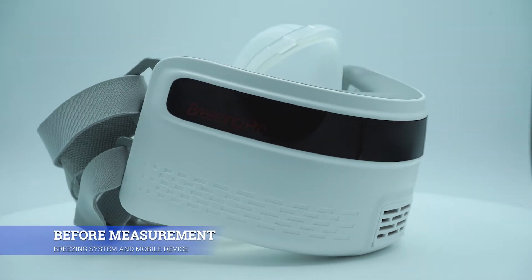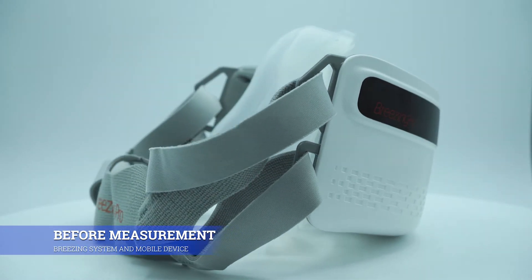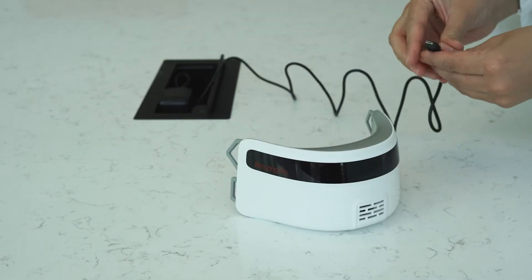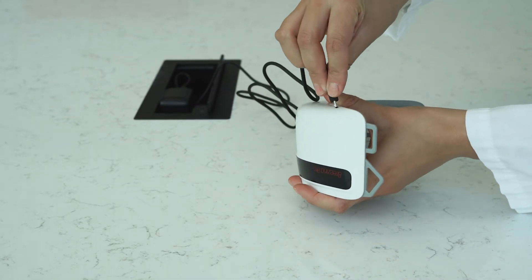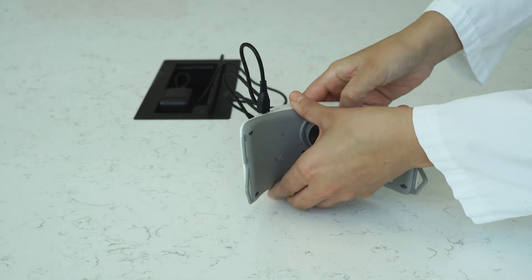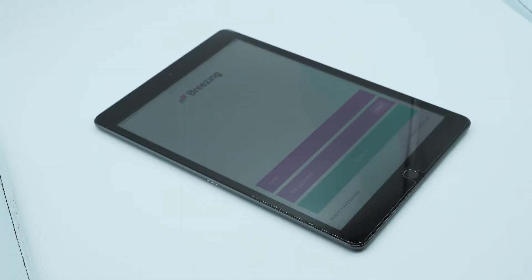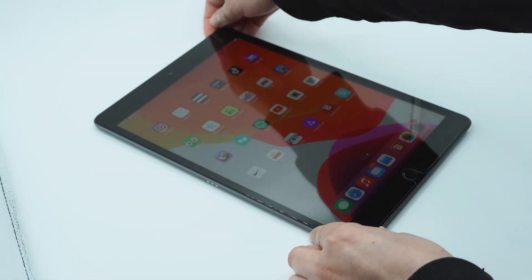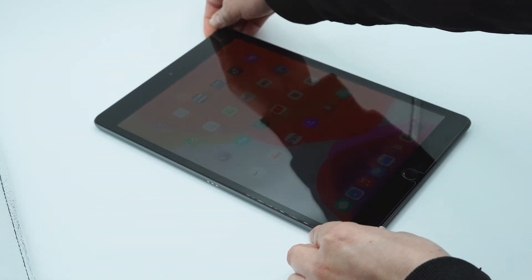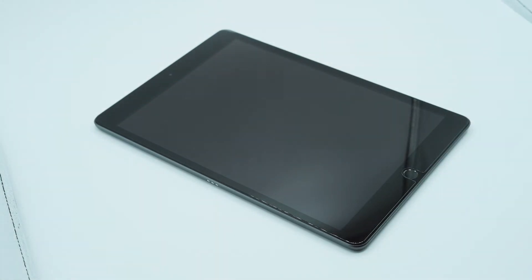Before starting the measurement, you need to make sure the preparation of your Breezing system and your patient. For your Breezing system, make sure both your Breezing device and your mobile device with the Breezing app are fully charged or plugged into an outlet. Before starting, reset your mobile device by closing the Breezing app and turning off your mobile device. This is a necessary step to ensure optimal processing conditions.